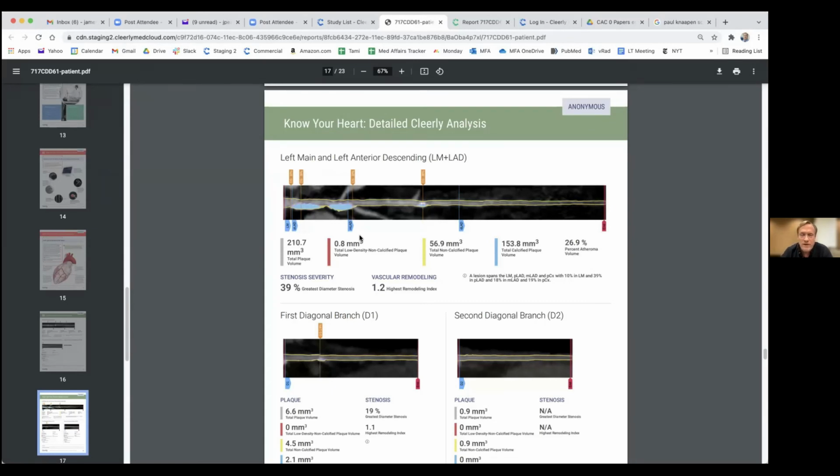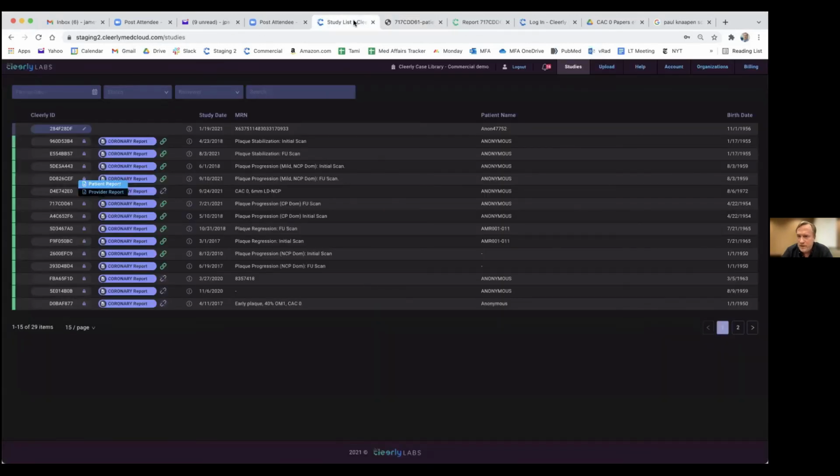So rather than relying on a very verbally dense medical report that's really not intended for the patients to use, for all of our analyses, we do provide these patient-facing reports that they can take home and hopefully be a little bit more adherent to either their medications or to whatever lifestyle changes the provider may be giving to them.